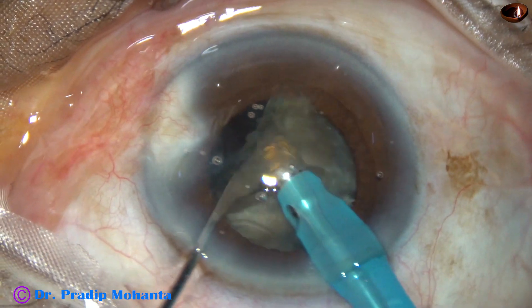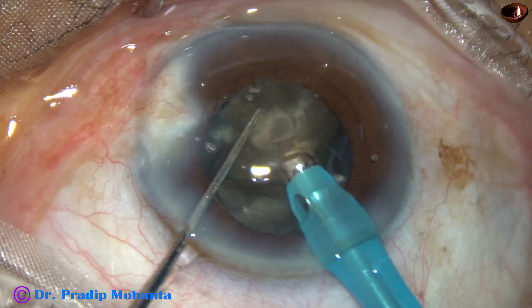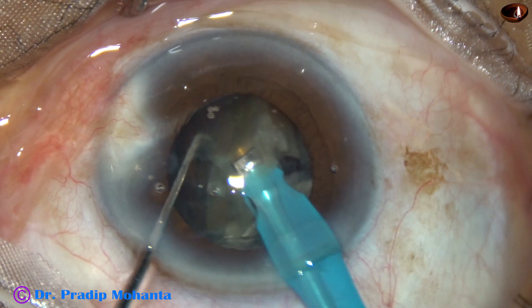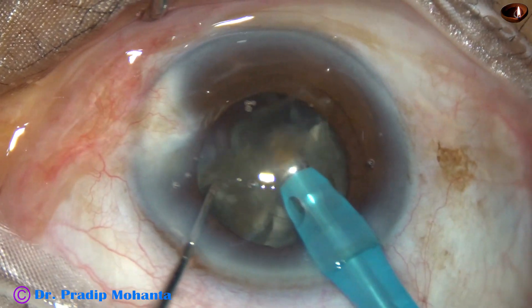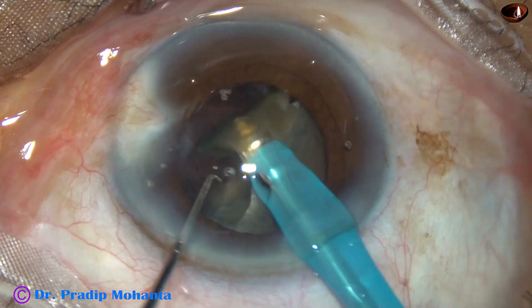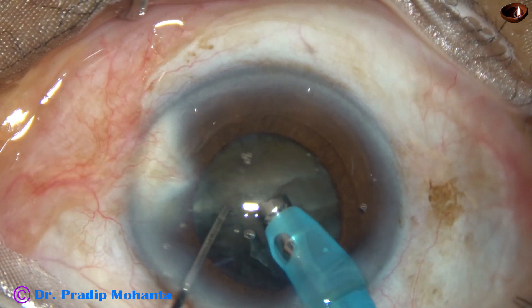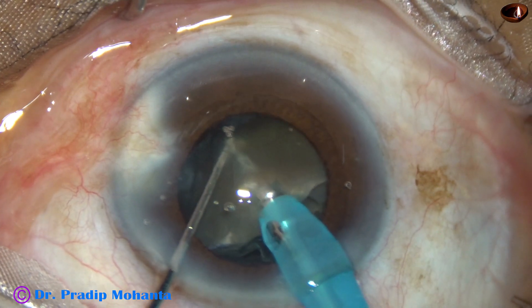The phaco power used in this case is 80%. Flow rate is 45 ml per minute, and vacuum is 450 mmHg. The machine being used is Faros with SPIP mode from Oertli, Switzerland. The chopper is designed by me — it is known as the Mohanta Chopper and is available commercially.